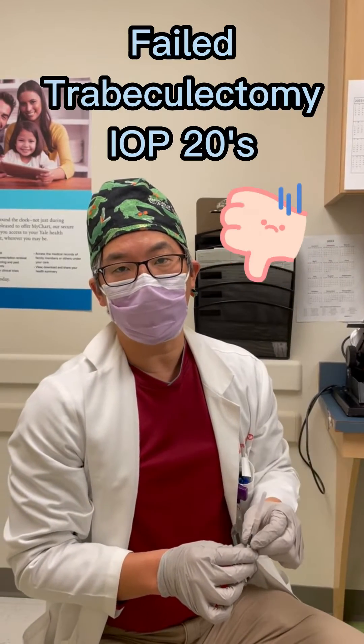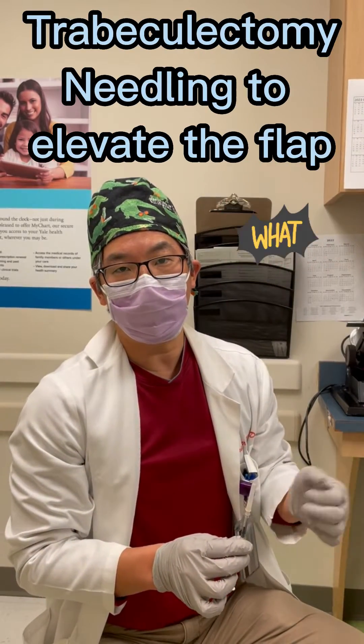Hey, how you doing? I got a failed trabeculectomy here. I'm going to do a needling here to elevate the flap.